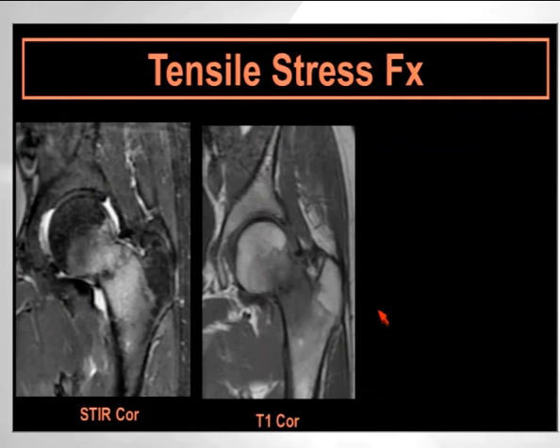And this is actually an unfortunate case. And that's why I sometimes feel in young women, there's some blurring of fatigue versus insufficiency fractures, especially because of the combination of anorexia nervosa and if you have a very highly motivated runner.